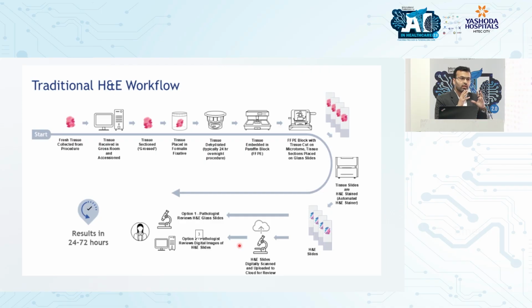Second thing is, all that information with your slide and the diagnosis can be fed into an AI engine. And you will definitely be able to come up with far better conclusions than with a digital pathology image alone.